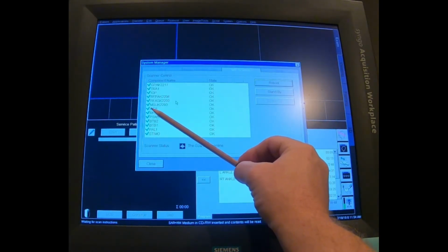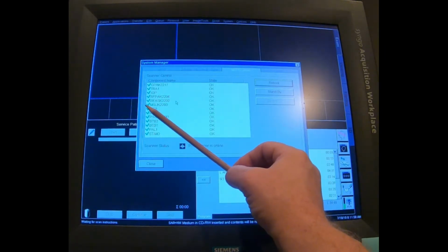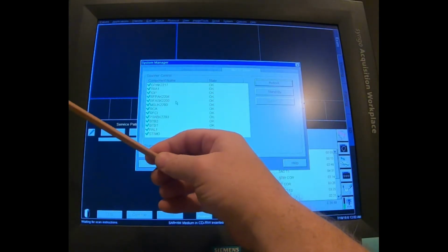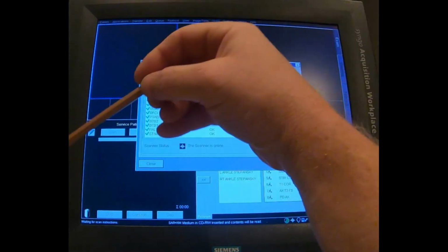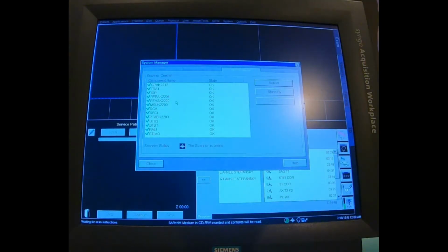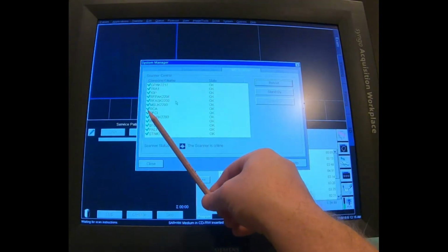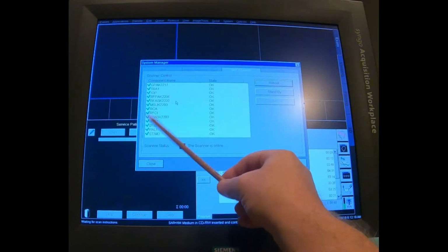The RFCI is the radio frequency cabin interface. That's everything in the back cabinet that's talking to the magnet room. So stuff like your coil connectors, the coil itself, the LCCS, the body tune box, the Talus, the BCCS. Patient table, body tune box 1 and body tune box 2.